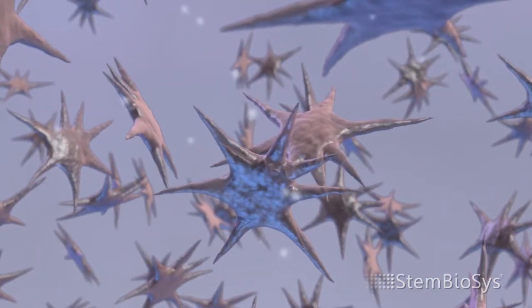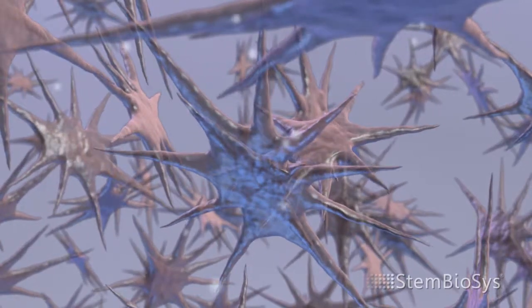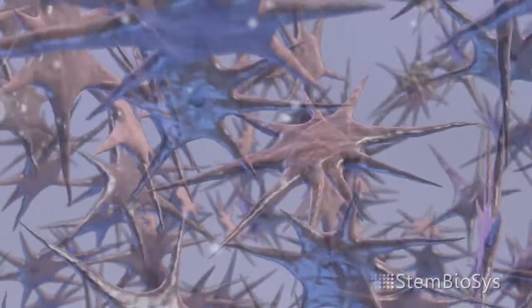The cells begin to divide, thereby increasing cell numbers and fully covering the surface of the cell culture dish or substrate.